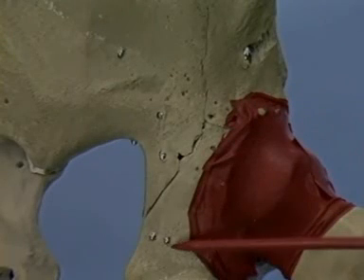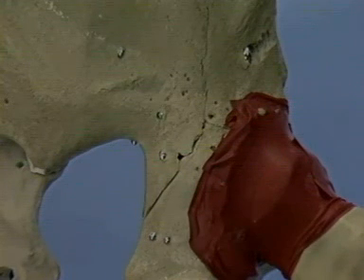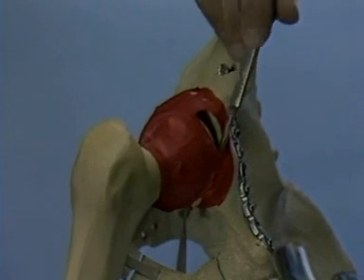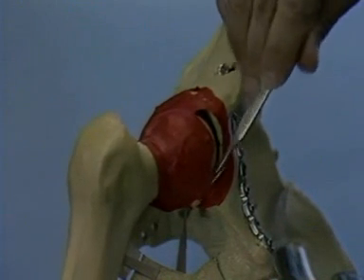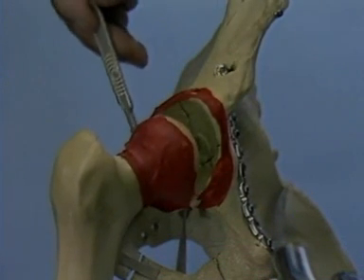On the outer aspect of the bone, the screws fixing the posterior column are seen to exit the retroacetabular surface just above the ischial spine. The final reduction of the articular surface cannot normally be directly visualized. However, for the exercise, we'll open the hip capsule to visualize the articular reduction.